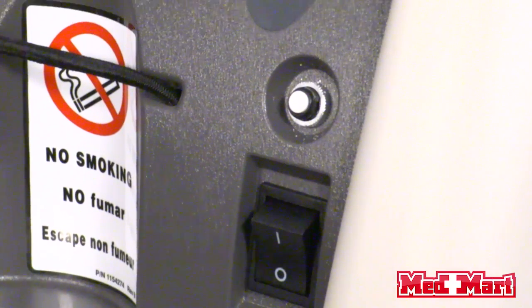Whatever liter flow your doctor prescribes is where you're going to want to set your flow meter. If your power is to ever go out, it's going to trip your concentrator — it's going to push the white button out — and to reset your machine you're going to need to push that white button back in whenever your power comes back on.